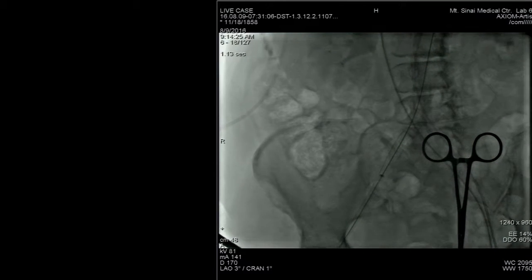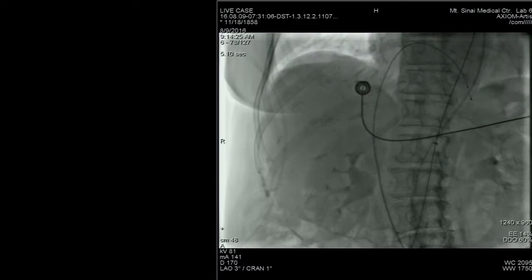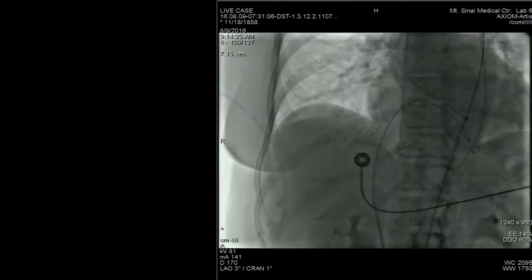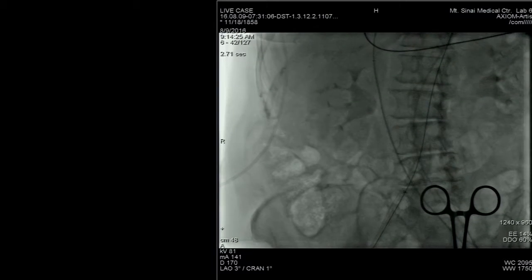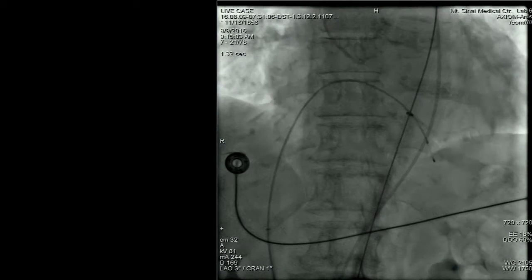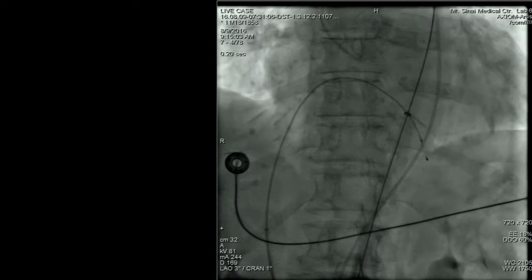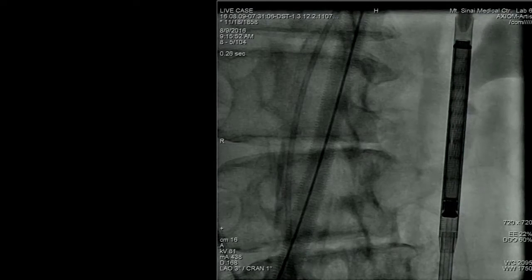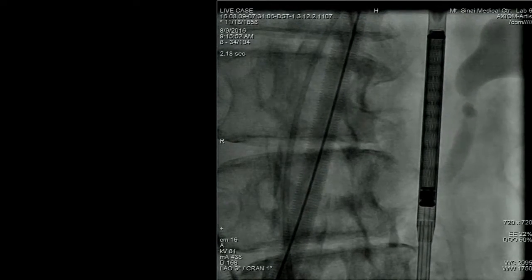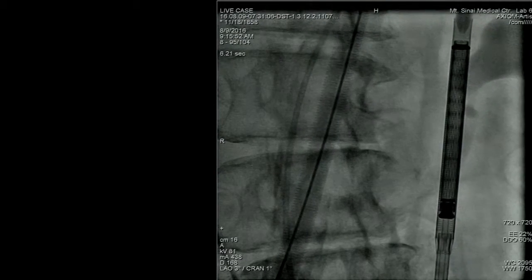The next step is we've placed two pre-closed sutures in the right common femoral artery where we took that access, and now we're introducing this 18 French SoloPath sheath with the pre-closed sutures already in place. And the final step is we inflate the SoloPath sheath up to 18 atmospheres. It goes in at about 12 with a nice low profile. Inflate the sheath to 18. Final step is we're checking our valve alignment, checking that the paddles are nicely seated on that valve, and we're all set and ready to go.